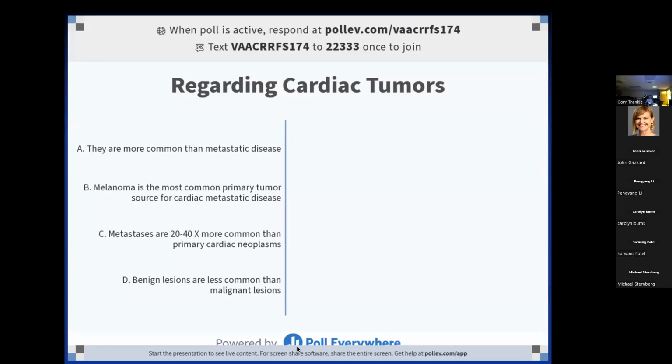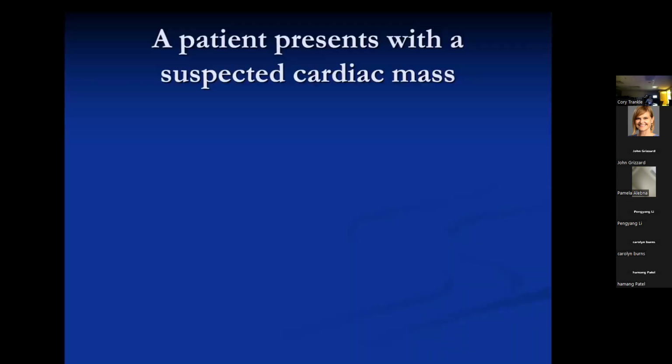Yeah, so far everybody who has chimed in is correct. And now we've got a 50-50 split, mets and melanoma. Okay, fair enough. So we're going to get to all the answers on this as we go along.